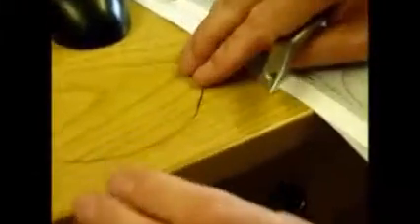We need to try and get the plane of the wire level, which usually means bending it here a bit until it goes reasonably flat. I suppose if you don't check for flatness every step, then there's a knock-on effect on the rest, and then it's really difficult. It's usually easier to get this bit right at this stage rather than later, just ploughing on.